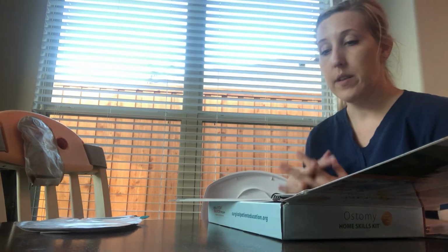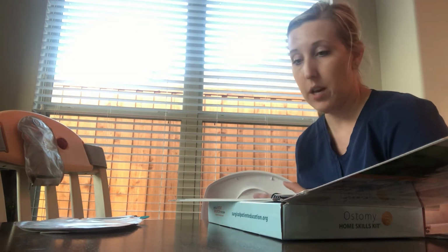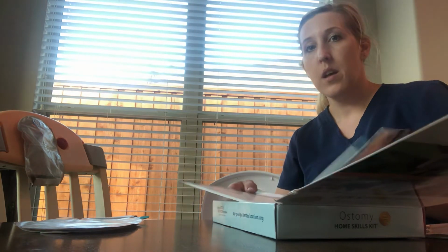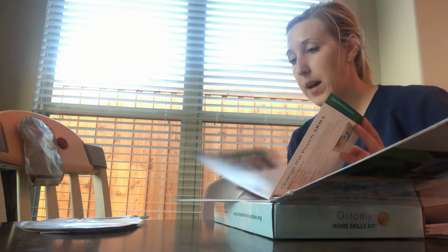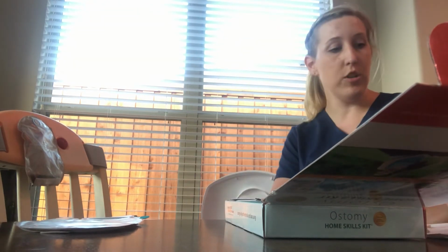We also have different accessories that are available to you. We have pouch belts. We have pouch covers that also help just to kind of keep it discreet. We also have in here the ostomy skills for emptying and changing the pouch. And we also have some problem-solving techniques. So now I'm going to walk you through how to remove your pouch.